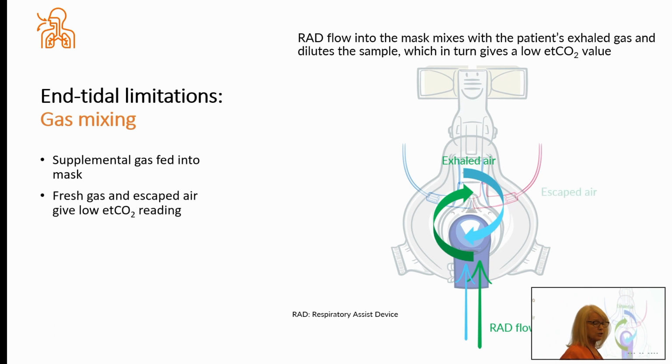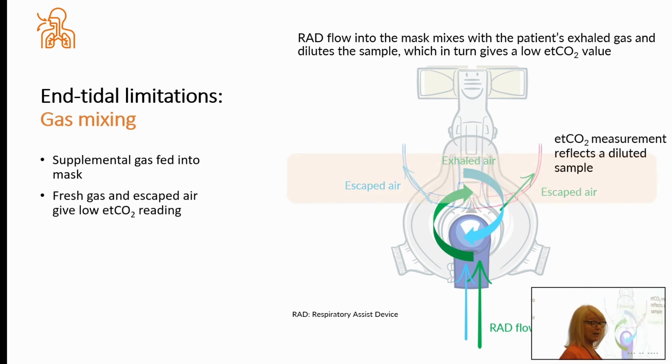One researcher states that in stable, intubated patients with no air leaks, end-tidal does have accurate correlation with your PaCO2. However, this cannot be achieved during non-invasive ventilation because of continuous flow through the mask and because of those air leaks. This researcher goes on to say that transcutaneous measuring of CO2 appears to be more appropriate for the continuous monitoring of a patient's CO2.